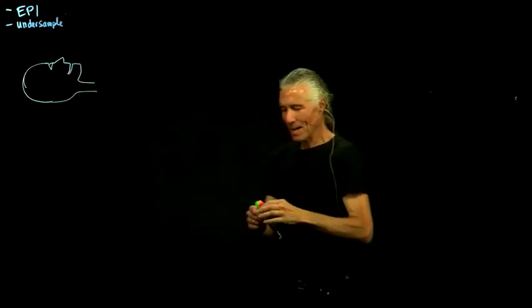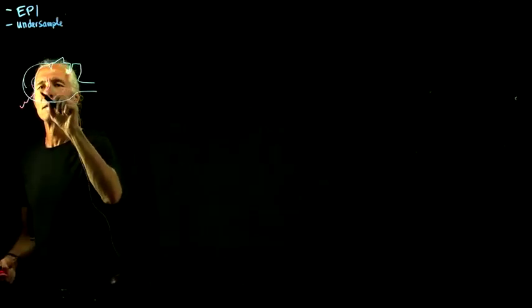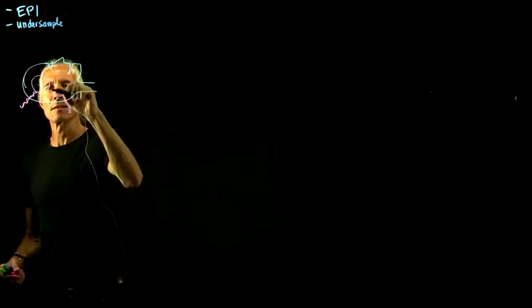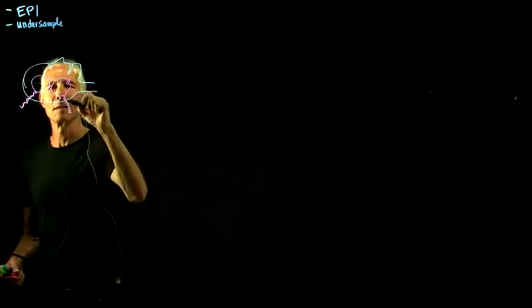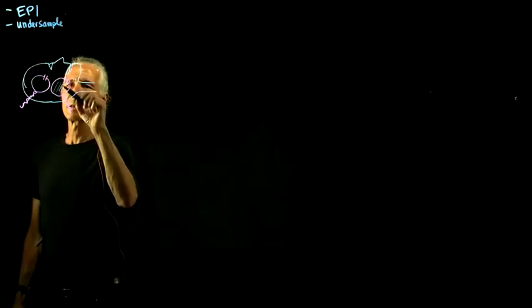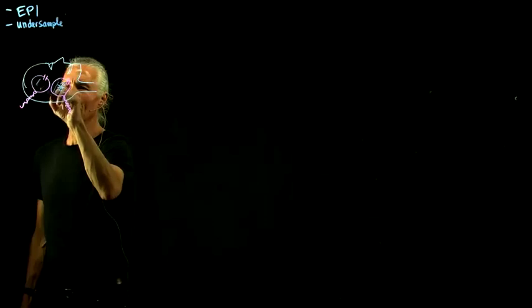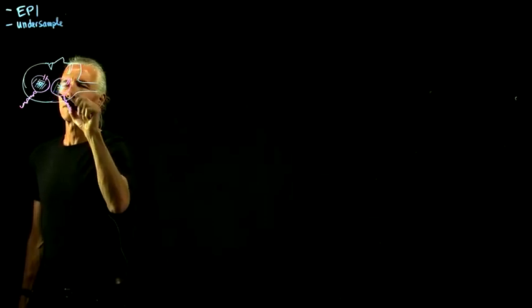And if you have one coil over here, and then you have another coil, say, over here, there's the capacitor. It's got a capacitor in it. And you imagine this coil over here is going to pick up really good from this part of the brain, and less from the other part. It'll pick up the whole brain, but it's going to have a little bright spot because it picks up better from this part.